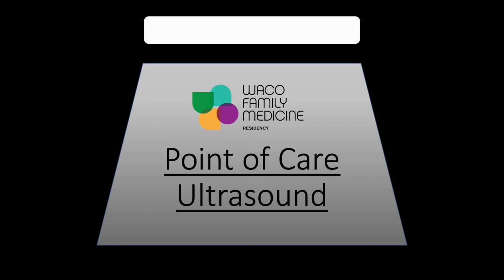So that's a summary of our point of care ultrasound for MSK. Once again, like I have mentioned multiple times in this module, this is an introductory course to MSK ultrasound, and certainly in our POCUS clinic or in your MSK clinics or your continuity clinics, you may discover other uses, and I would encourage you to do so. But this is sort of the taster sampler platter of the different ways that you can utilize it.